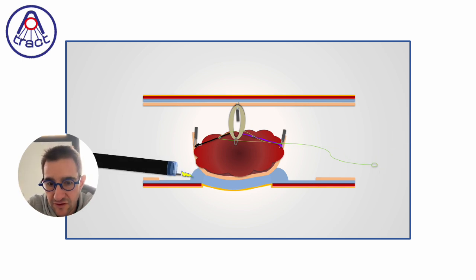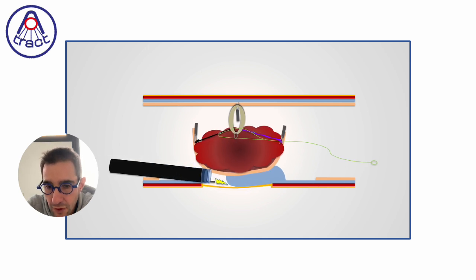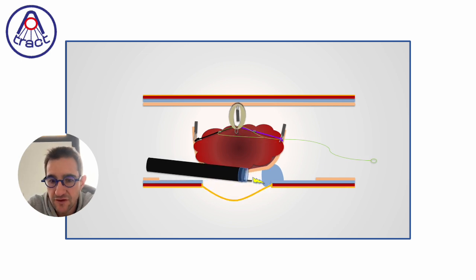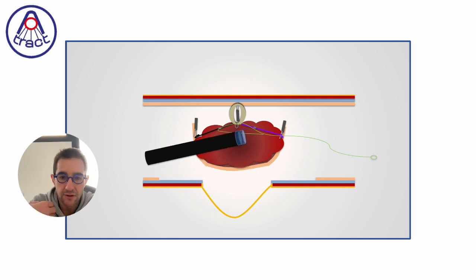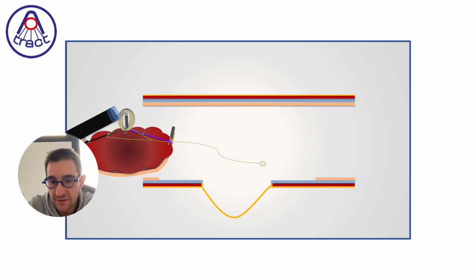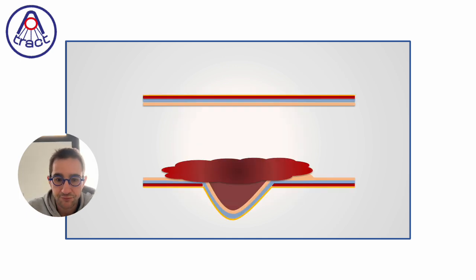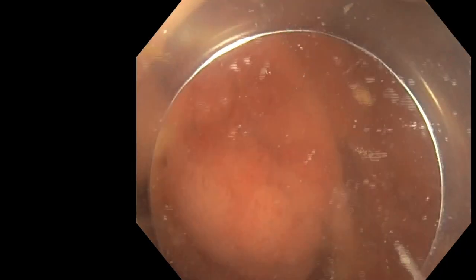removing all the submucosa around the deepest part of the diverticula, and once the traction goes down, we can, if needed, tighten the device, increase again the traction, and remove the lesion, and at the end the diverticula will come back, will appear again, because the traction will go down. So this is the case.